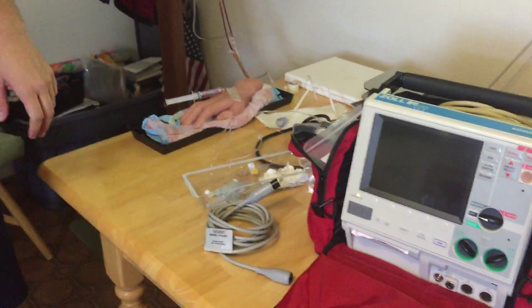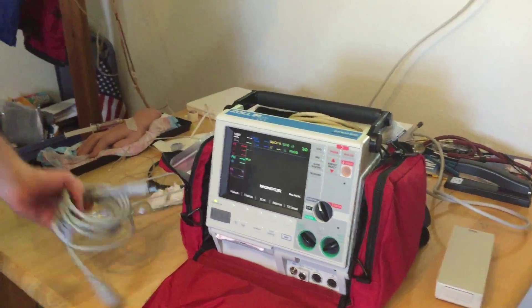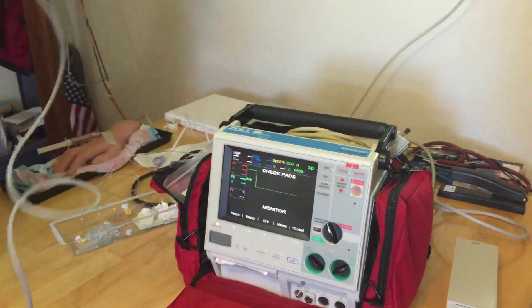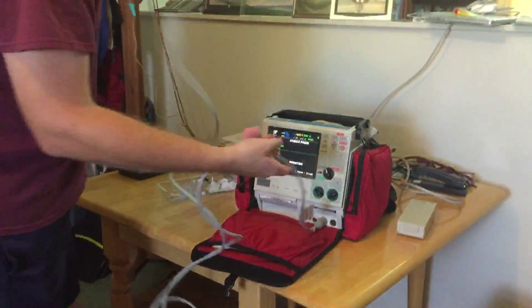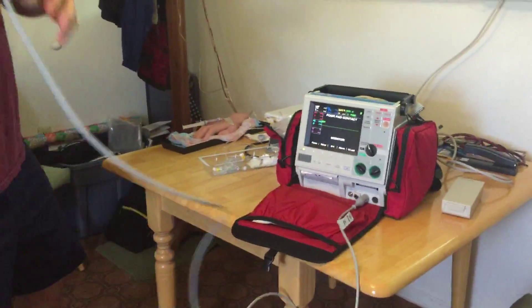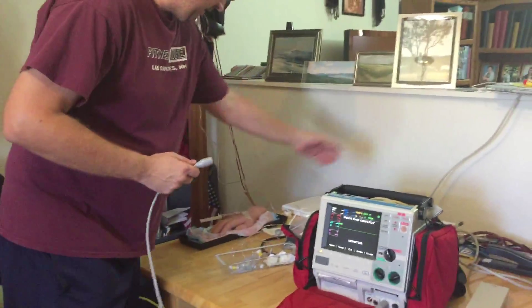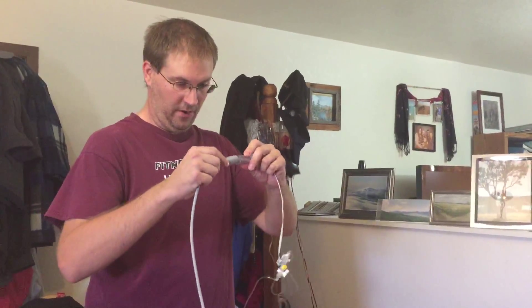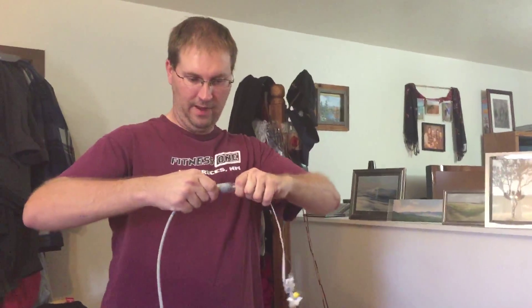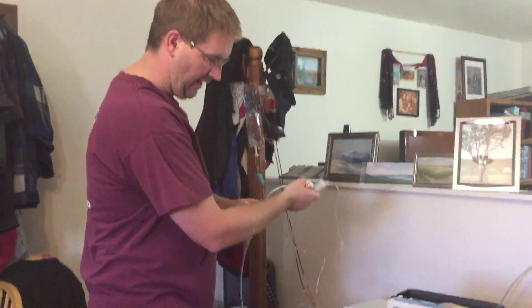Now I'm going to go ahead and go to the monitor over here and turn it on. Then I'm going to take my cable — I have a cable that plugs into the monitor — and this end is what hooks into my invasive line. The TransPak connector has a little arrow on it; you just line the arrows up, it clicks into place, and we're good to go. The monitor is now recognizing that I have something hooked up.